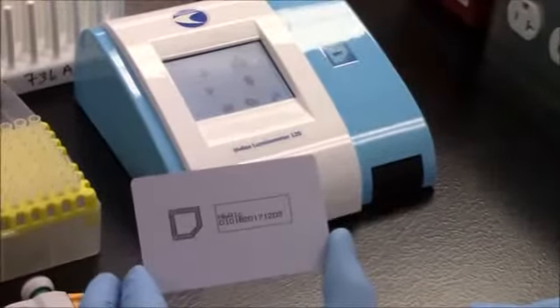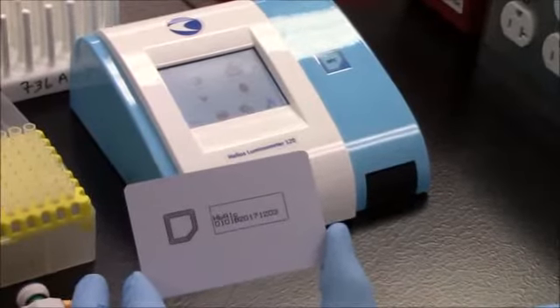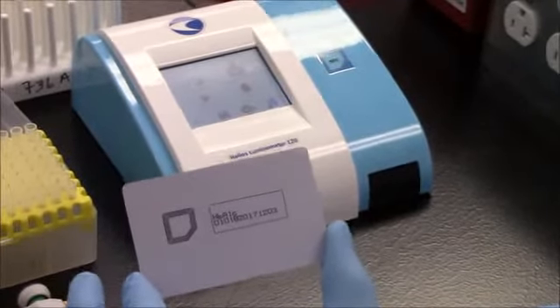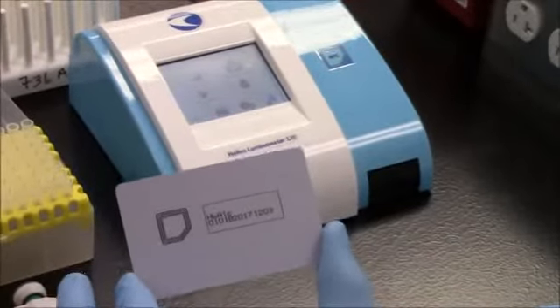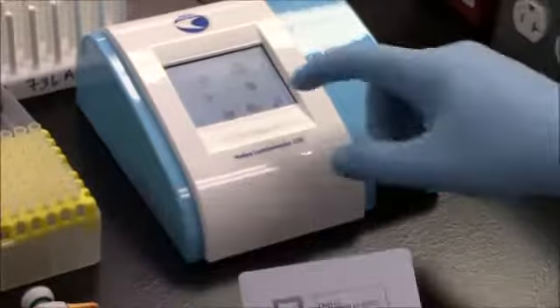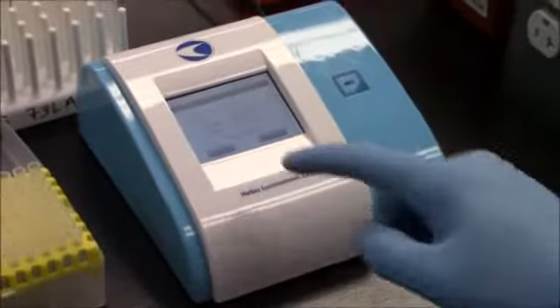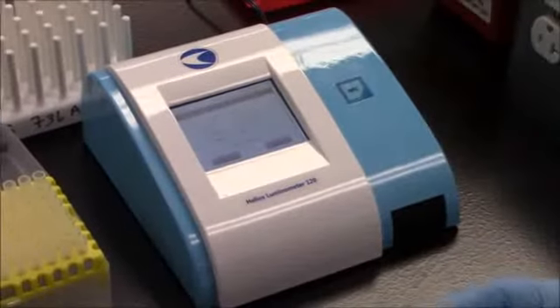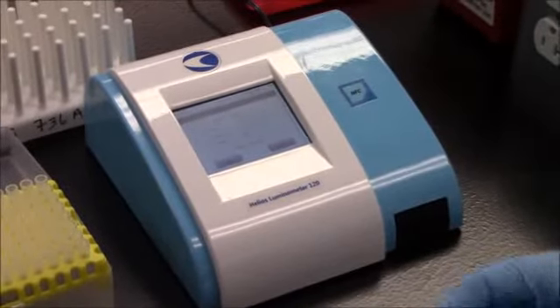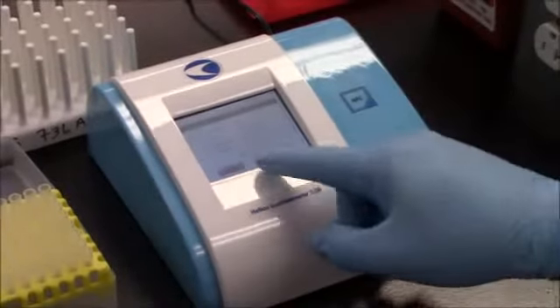This is the NFC card. The NFC card is for loading kit reagent calibration information. This is only scanned once. The calibration information will automatically save to the machine until the next kit is loaded. To use the NFC card, first enter the calibration menu. Then click Read. Once you've clicked Read, wait 3 seconds before placing the NFC card until the machine displays Read Successful.